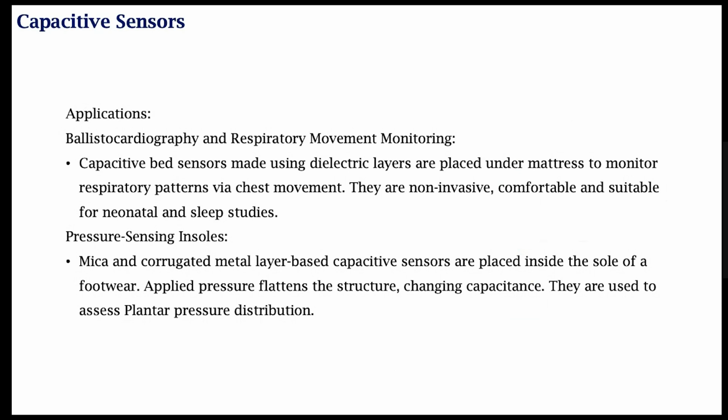As the person is breathing out, more air will go, and there will be less load on the person. By the way, that means your dielectric layer sensitivity must be so high to detect these movements, and it's absolutely critical to have this as a non-invasive device. Why is that?